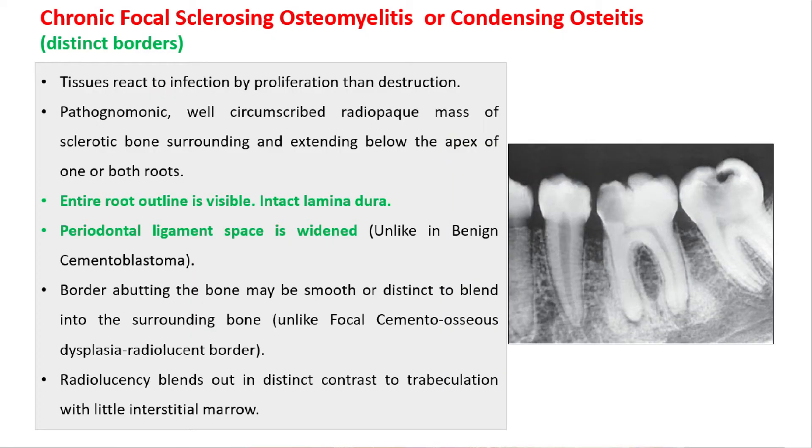In chronic focal sclerosing osteomyelitis, as the name suggests, it is focal and sclerosing. We see a well-circumscribed radio-opaque mass of sclerotic bone with distinct borders, surrounding or at the apex of one or both roots. It is also known as condensing osteitis. Radiographically there is widening of the periodontal ligament space with intact lamina dura. It can look like focal cemento-osseous dysplasia, but there will be absence of a radiolucent border.